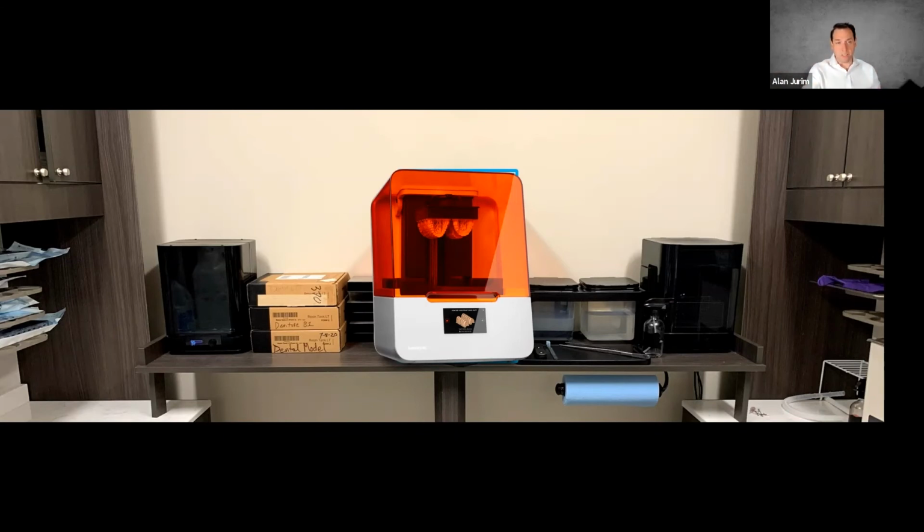That has an agitator in it. There's a little metal bin that will actually raise out of the unit, and it automates the final rinse. By keeping the alcohol in this orientation, from dirtiest to cleanest, we don't go through as much alcohol, IPA, isopropyl alcohol, to clean the restorations. By the time it comes out of that last bath, it should be the cleanest. It shouldn't have a very sticky nature to it. Also, that's set up on a timer. After 10 minutes of rinsing, it raises that tray, with whatever you have inside it, out of the alcohol and allows it to air dry.